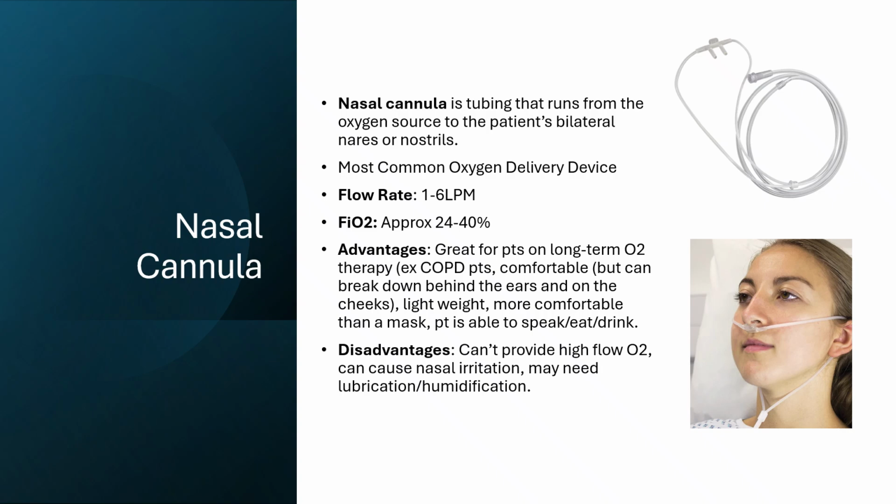So it's not a bad idea to do some lubrication or humidification. And then just like I said, be mindful that it certainly can dry out those nasal passages. So you've got to be mindful of that. The other nice thing is some of these nasal cannulas will actually come with CO2 detectors on them also. So it's a good way to monitor your patient if they're sedated or they just need a little bit of extra support.